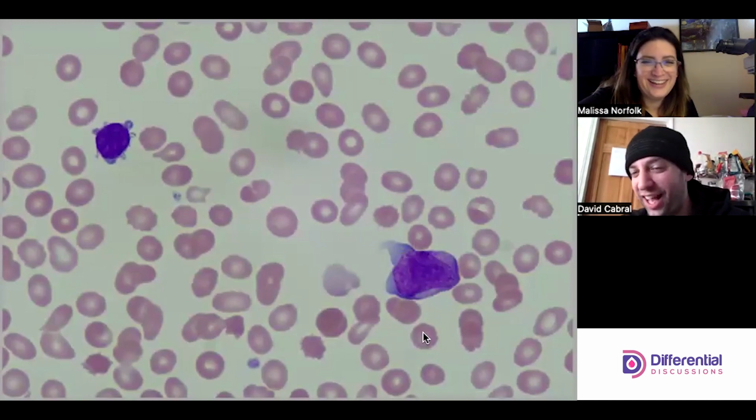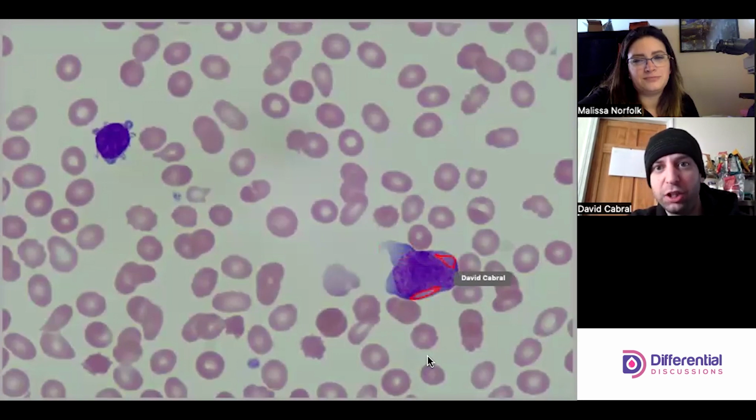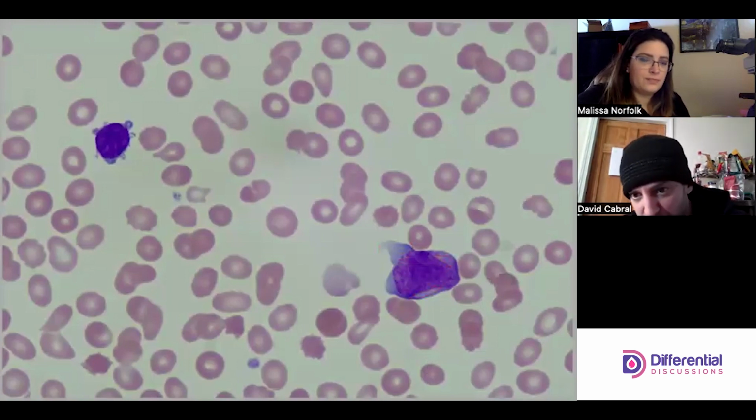And the other thing I'm looking at is the cytoplasm. So there's this deep basophilia that's beautiful. I would attribute that to reactive lymphs might have a coloration like that, and blast forms will have that kind of deep basophilia. But then I have this beautiful shading of pink that's happening, and even to maybe a lesser extent down over here. So that's showing us where these microgranules are, these promyelocytic granules that are shading the cytoplasm.